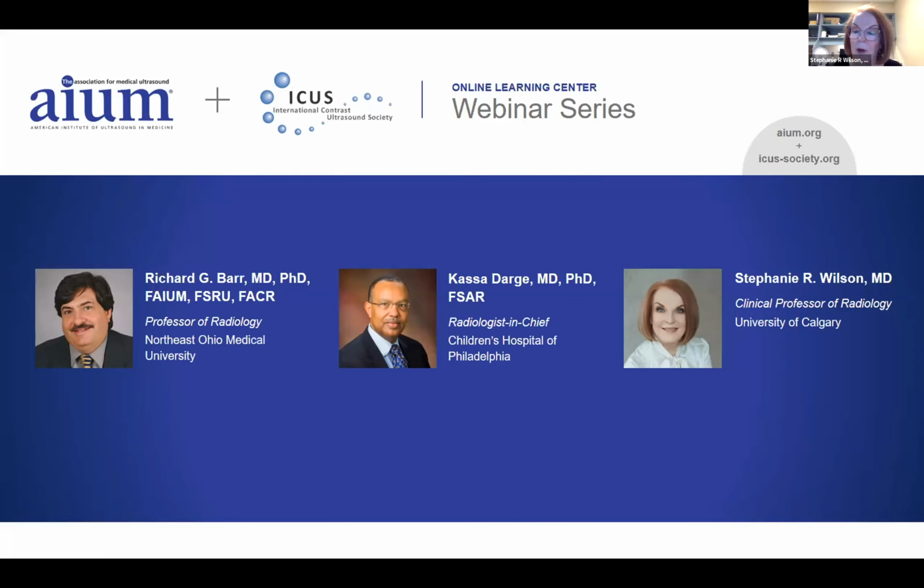And maybe at that point, we might also just make the comment that was made very strongly in the presentations, which was terrific, that certainly off-label is not illegal and it's not bad. And so I know that Richard and Kassa and I all do a tremendous percentage of our work off-label. Yeah. And so those are both important points.